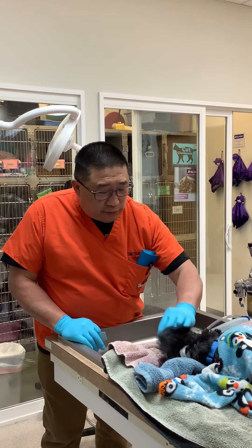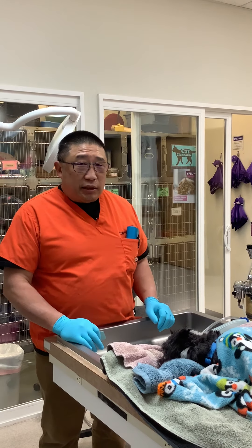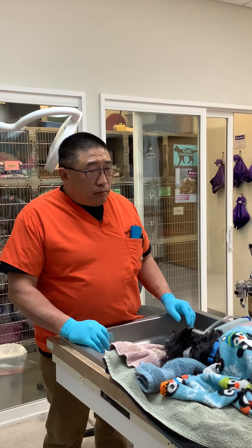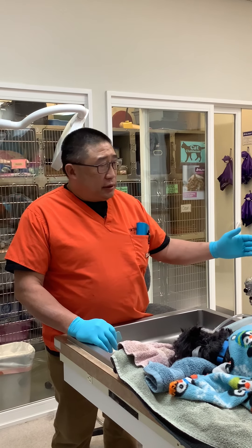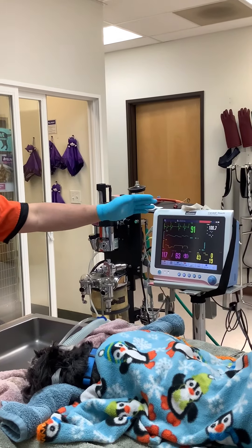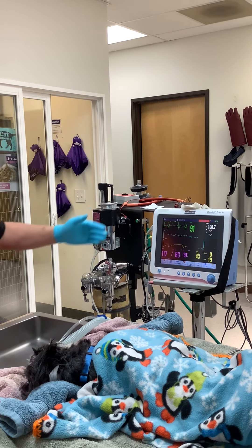We have a little dog here that's under anesthesia for a routine dental cleaning. We're about ready to take some x-rays, so we'll take a quick moment to go over what our anesthetic monitoring devices are. This is the Cardell monitor — it checks a whole bunch of things.